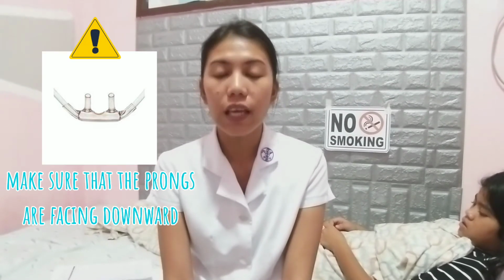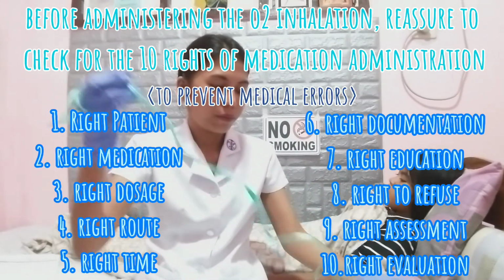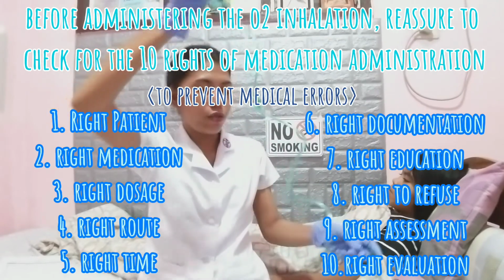Next we are going to do the application of the appropriate oxygen delivery device. This is done by putting the cannula over the client's face with the outlet prongs fitting into the nares and the tubing hooked around the ears. Proper positioning allows unobstructed oxygen flow and eases the client's respiration. Check for tube patency.